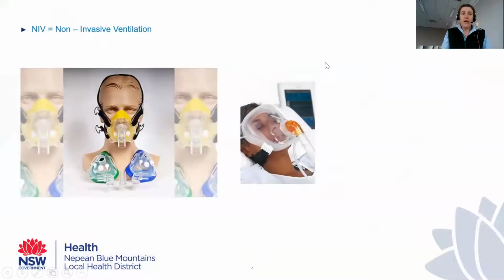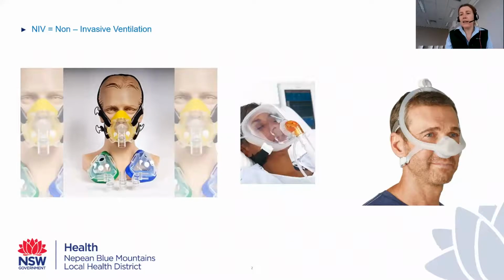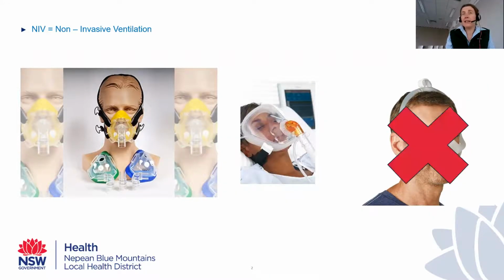So, non-invasive ventilation is, ventilation refers to pressures. So we're applying pressures, and in BiPAP, we're doing that both on exhalation and inspiration, and we're doing that via a mask. So either a mask that covers the nose and the mouth, or a full face mask. We would not use a nasal mask in an acute setting where a patient has an acute respiratory issue. We can't deliver guaranteed pressures because the gas flow leaks out through the mouth.